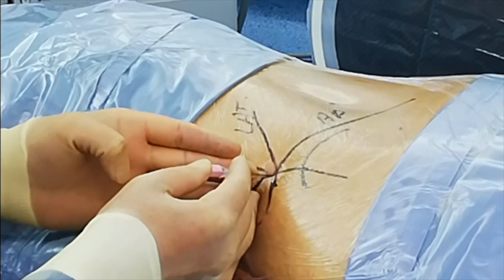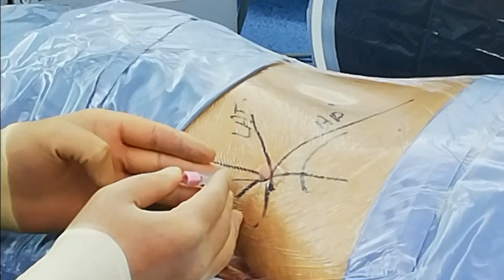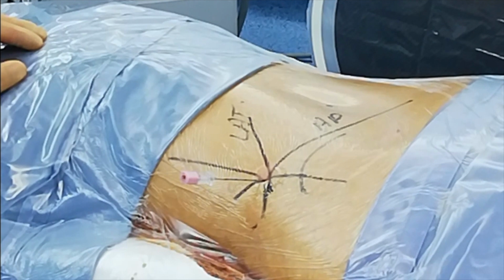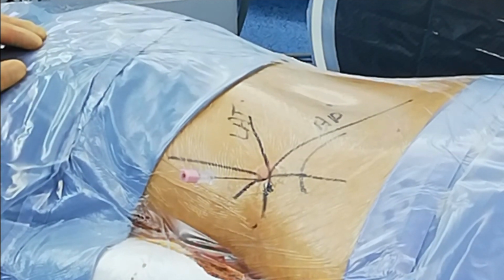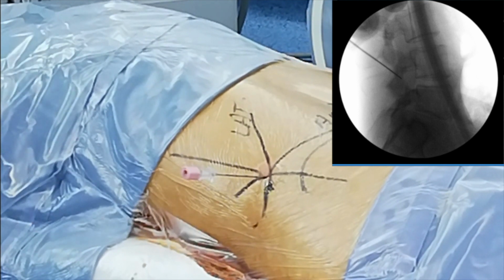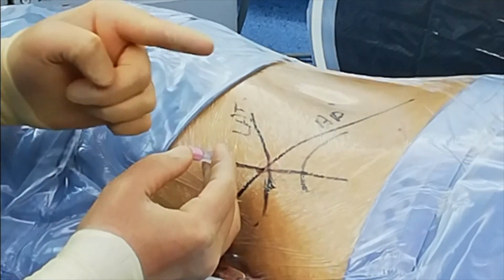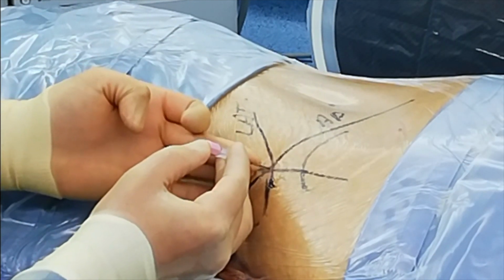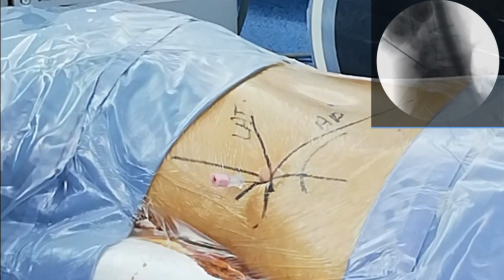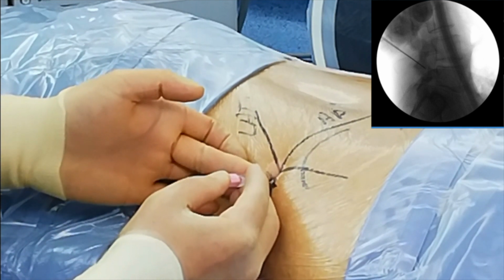So basically, I will feel feedback from the movement of the leg if we are near the exiting nerve root. X-ray please. So I'm hitting bone now, so I check on the X-ray. My trajectory is not bad. I need to go more anterior because I'm hitting bone, so I keep my craniocaudal trajectory. I just go a slightly more anterior angle. X-ray please. And that's a bit caudal, so I need to just modify that.